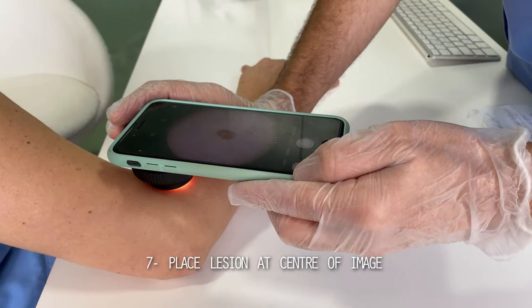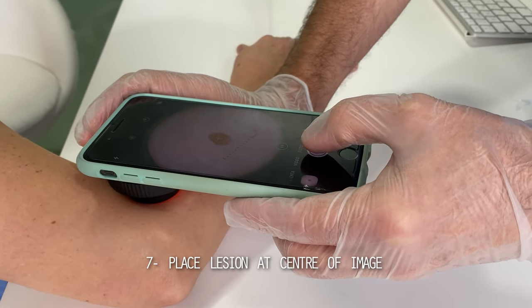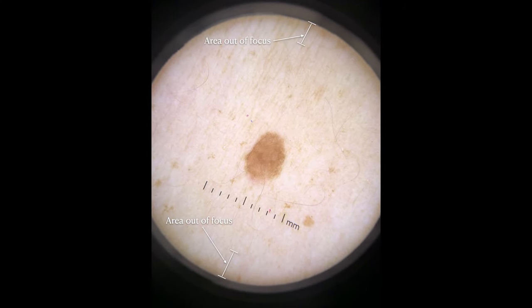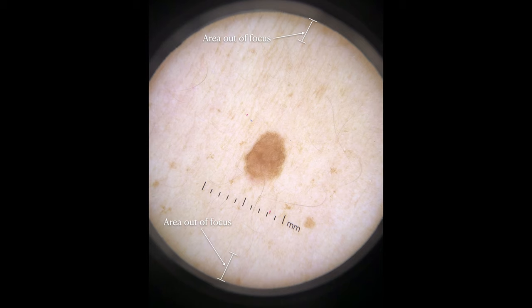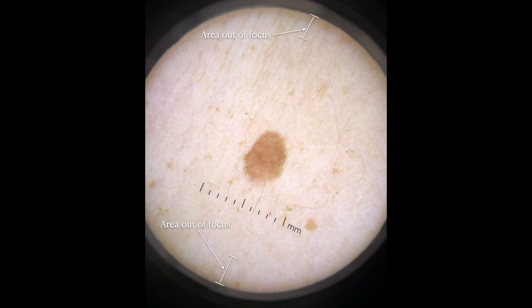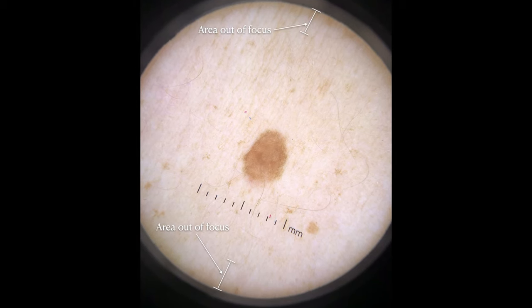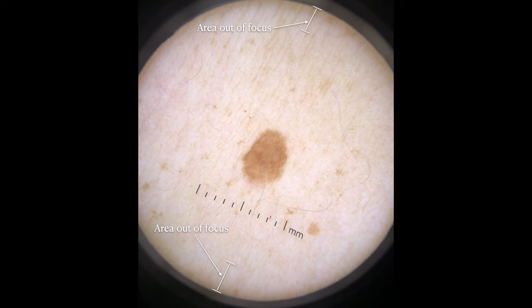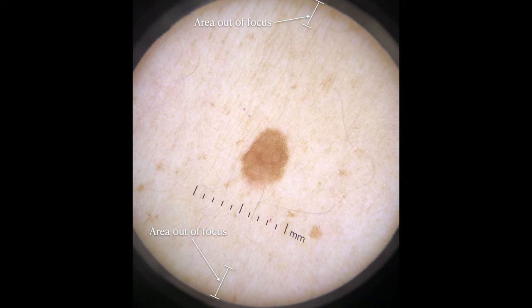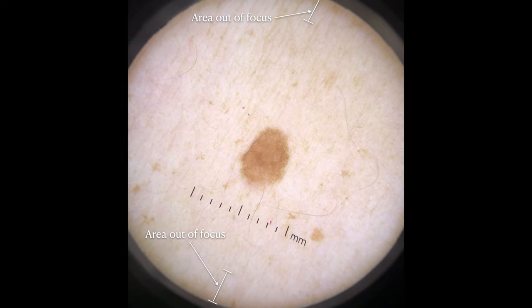Point number 7 refers to the placement of the lesion that we want to photograph, perfectly centered within the composition of the image, and again with the dermatoscope totally flat and parallel to the axis of the skin. As a result, we get an image where the defocused areas are restricted to just the edges and with no visible shadow. We have to consider that a dermatoscope's lens is basically a magnifying glass, and as such the edges of the resulting image will always have some distortion and loss of quality.